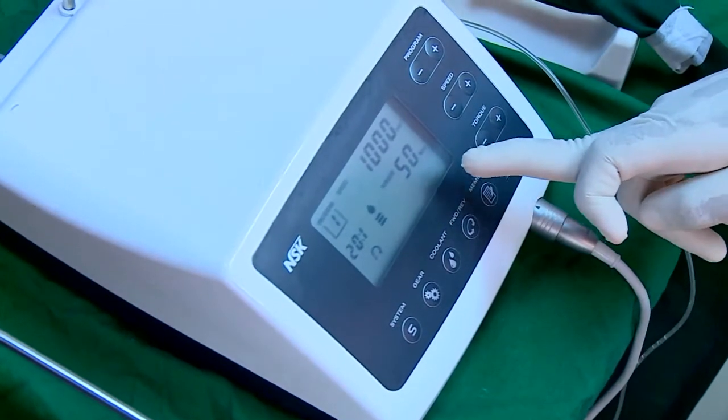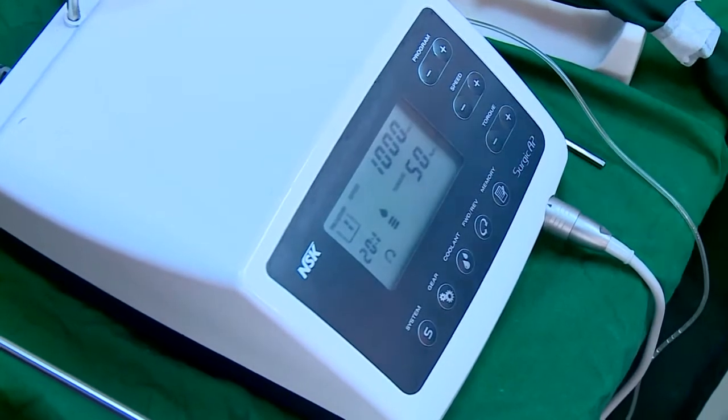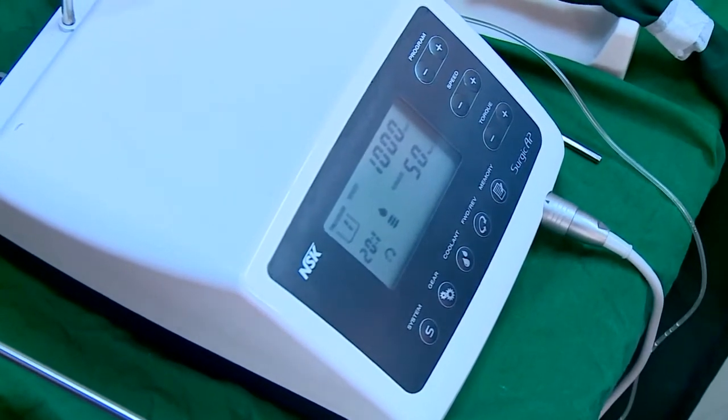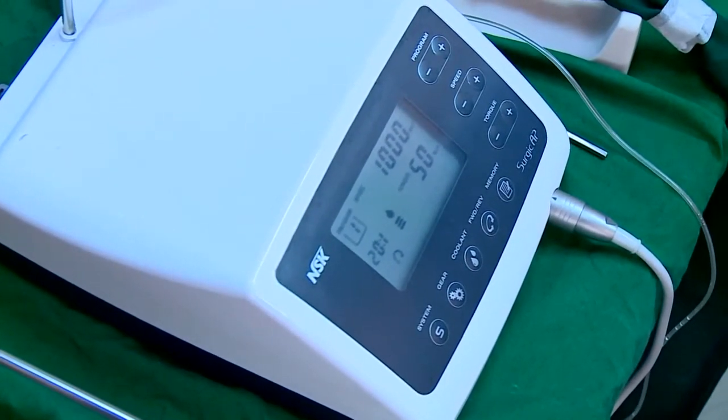You can set up the torque. We are talking about low speed, high torque motors whenever we are talking about physio dispensers. They are like a sophisticated micro motor. That's how they are.